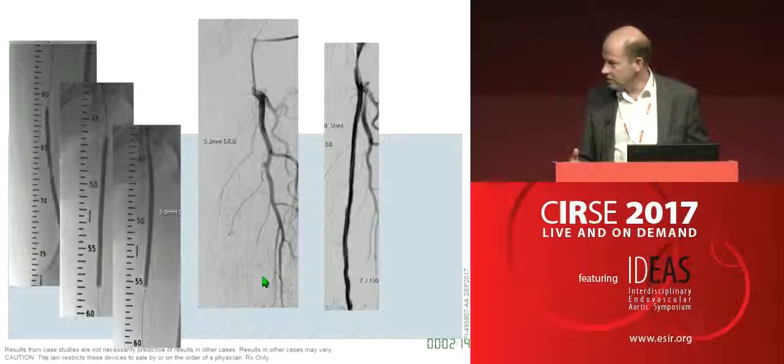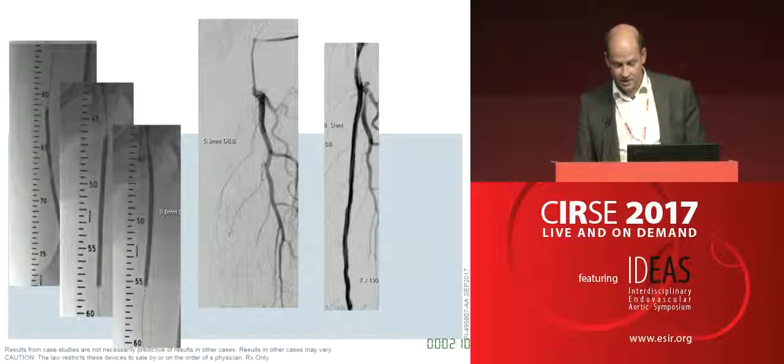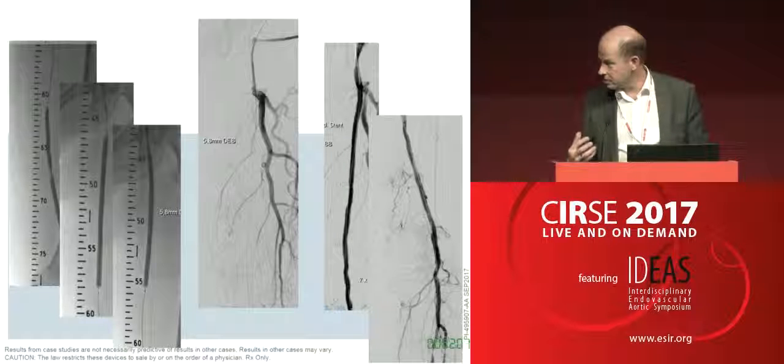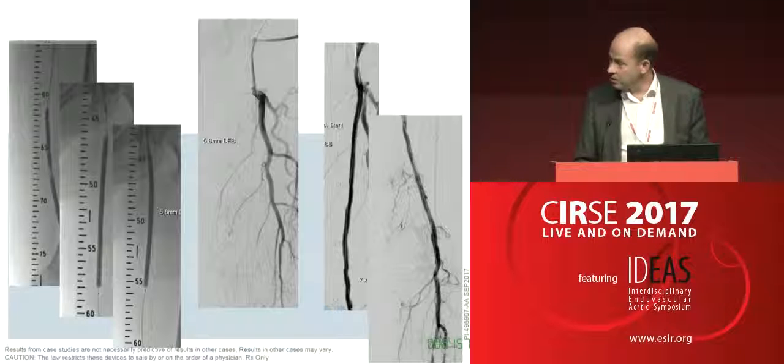So I used the drug-eluting balloon, and the dissection got worse. And then at the end, as you see over here, I had to stent the whole thing. But first of all, drug-eluting balloon first, and then stent. My personal learning point is that it might also be a good option to go with drug-eluting stents first. Nevertheless, here we have drug elution and placed the stent second.